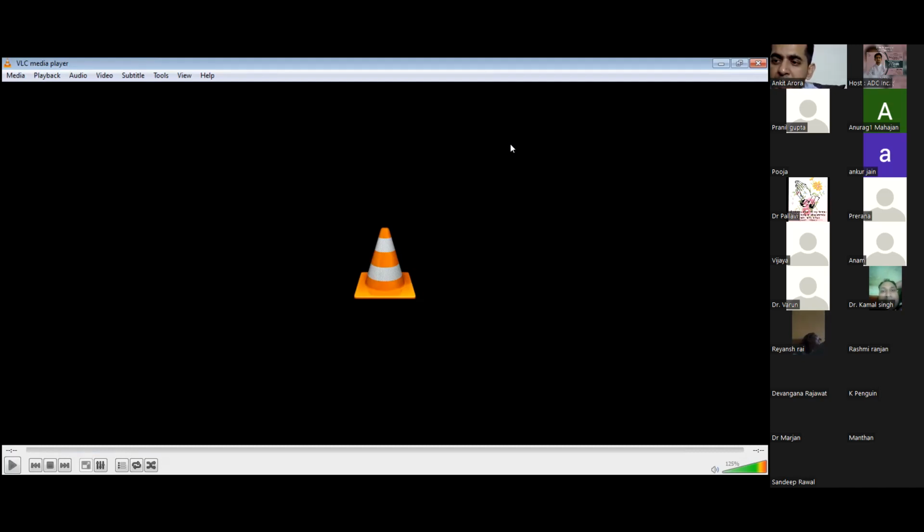In most practical scenarios, when you elevate it, you would find that the distobuccal margin of the 8 will be hindering, because most of the time it delivers in that manner, except for the distoangular tooth. So you need to gutter it more. You need to remove the distobuccal margin more of the wisdom tooth, right? So this is a hit and trial permutation combination of how you would win the tooth. How would you win the race?